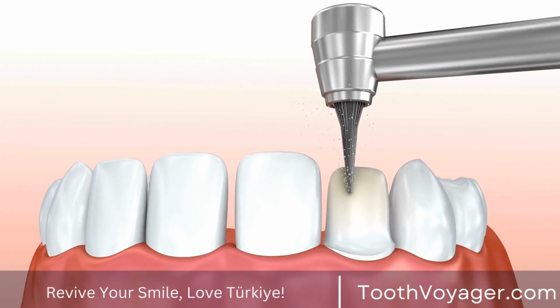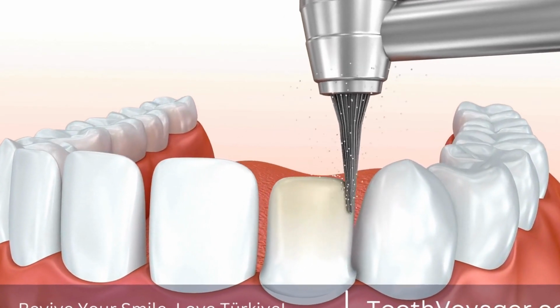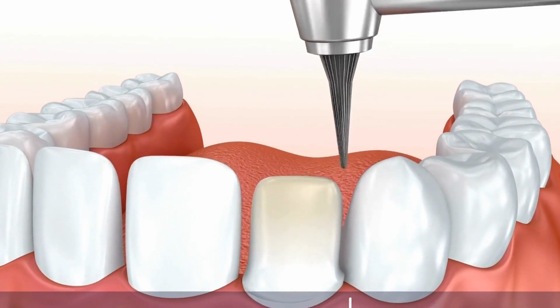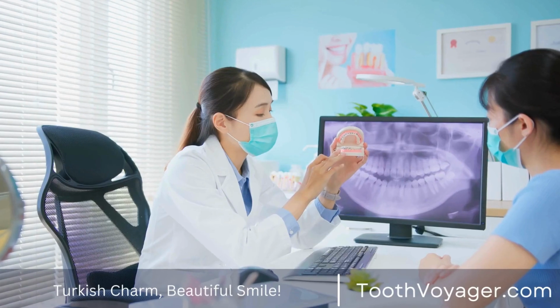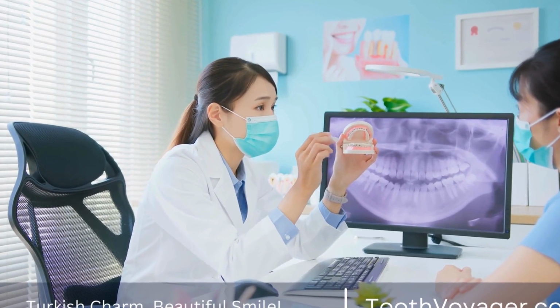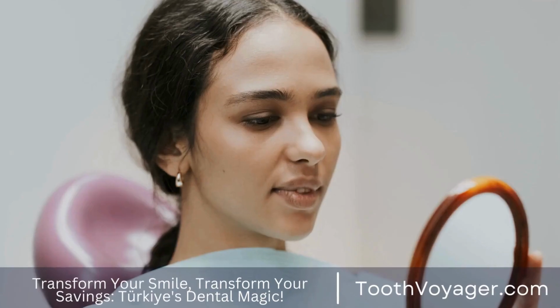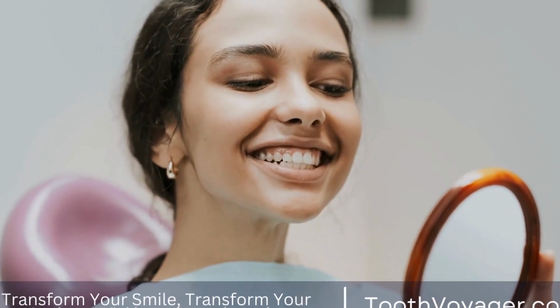This not only improves the chances of a successful implant procedure, but also helps to prevent complications such as implant failure, bone resorption, and sinus perforation. Bone grafting also helps to preserve the structure of the jawbone and prevent further bone loss over time. By maintaining the integrity of the bone tissue, bone grafting can help to support long-term dental health and improve the overall aesthetics of the smile.